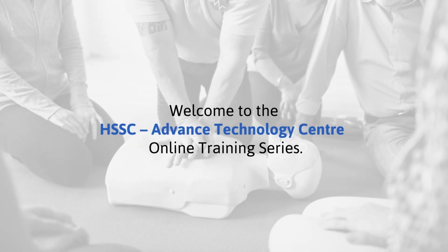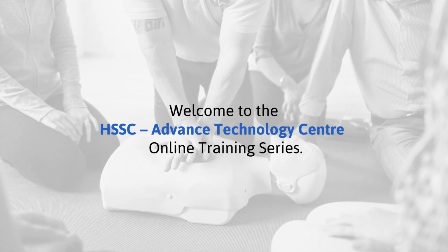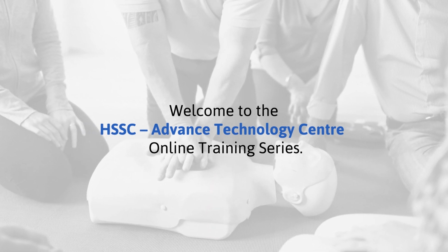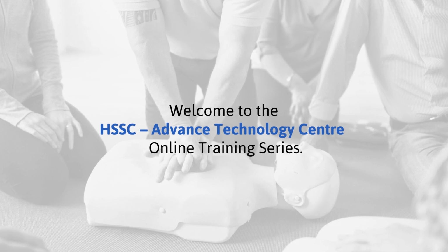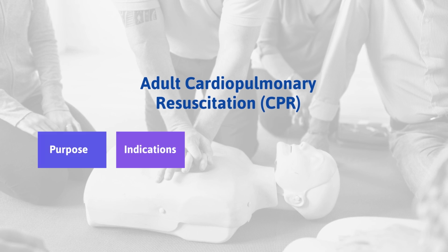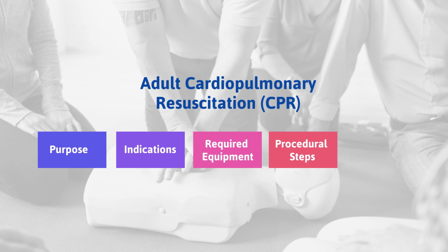Welcome to the HSSC ATC online training series, where we equip healthcare professionals with essential clinical skills to provide high-quality patient care. In this session, we will cover adult cardiopulmonary resuscitation, CPR, including its purpose, indications, required equipment, procedural steps, and error prevention strategies.